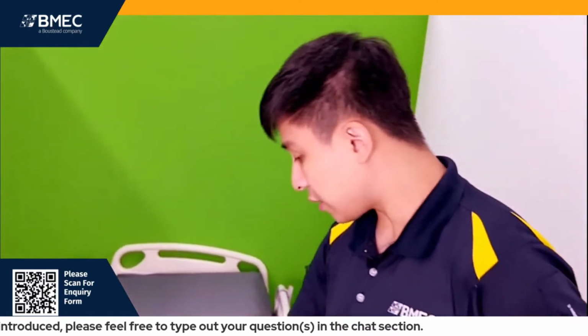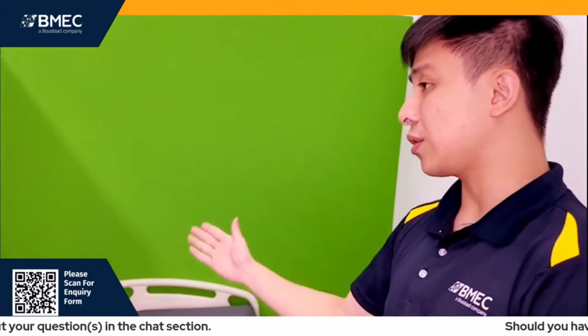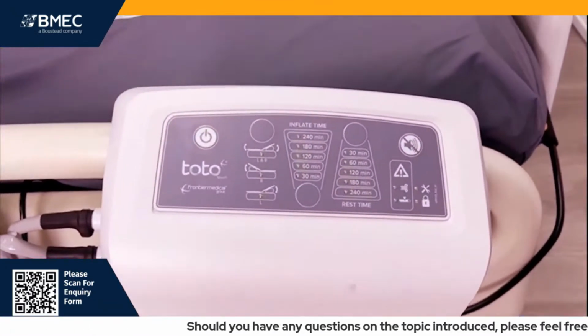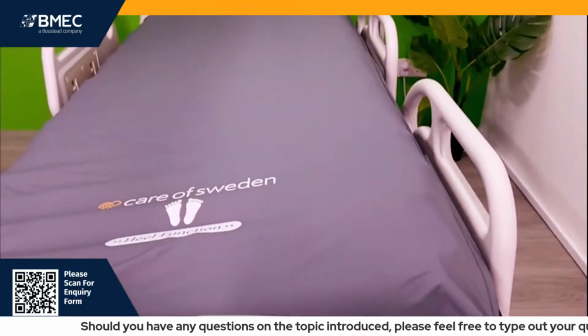Of course, after describing how the patient is being turned sideways, how does the patient turn back to supine position? Simply turn it off as well. Long pressing it would turn it off. So the patient would slowly be back to the supine position.